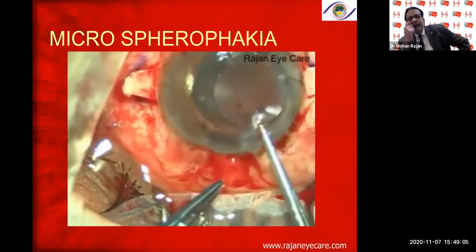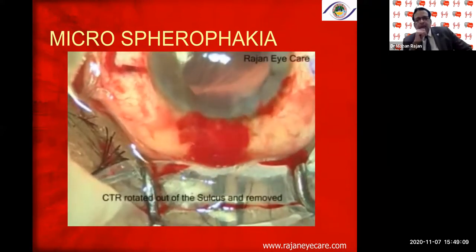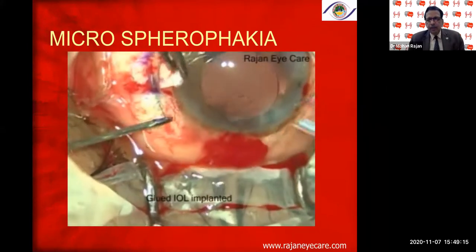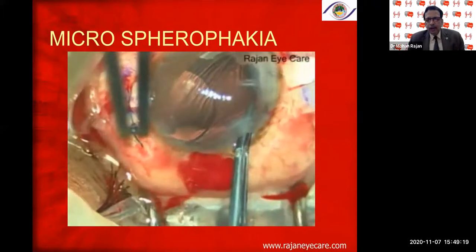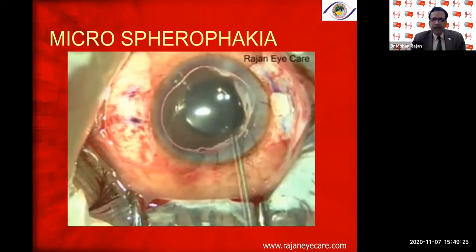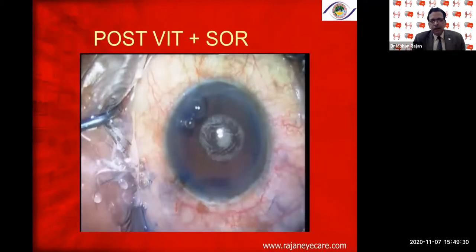I immediately made these two flaps because I prefer doing glued IOLs for these patients, because a glued IOL is a secondary IOL. Nowadays I've stopped doing these sutured IOLs and scleral fixation. So I always do glued IOLs. You can see here, I made the two flaps, and that makes life easy. This patient has about 3-year follow-up with 6/9 vision.